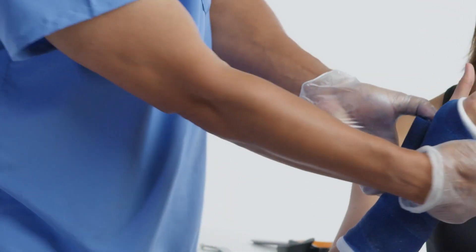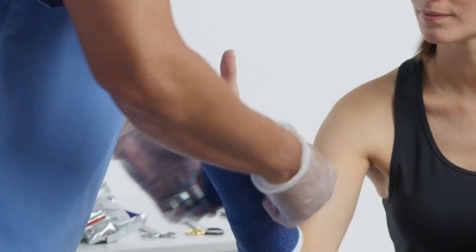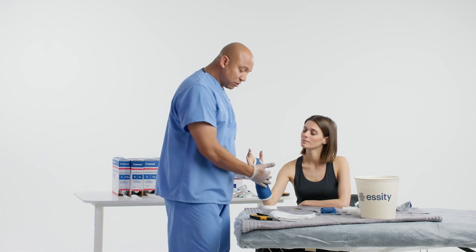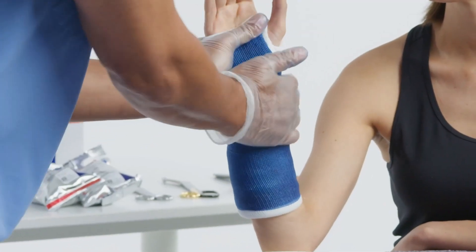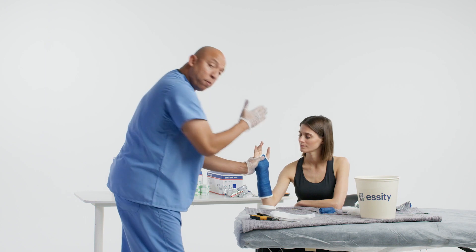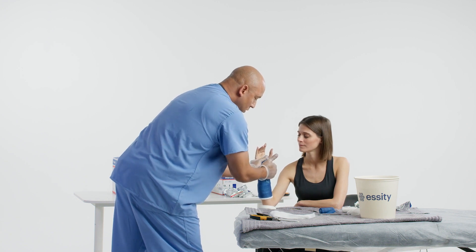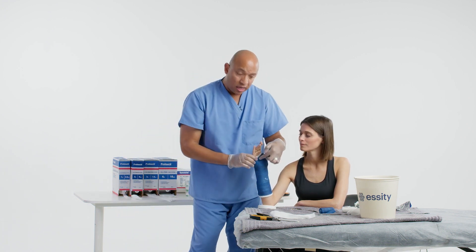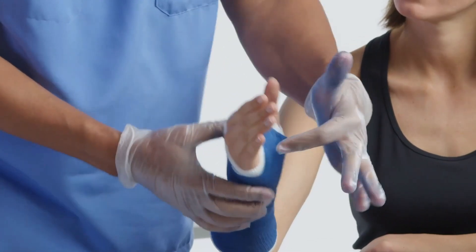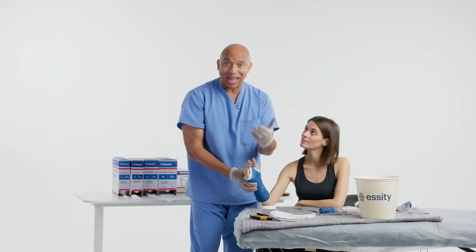I've folded it on both sides — now I'm just going to lock that in and finish out the last portion. Again, we want to laminate this last roll, so I'm just going to turn the hand around, take away that space in that palmar area, and put her back neutral. When you get done, you should see a more contoured look in the palmar area — we want to take away the space between the palm and the cast. We don't want a big club-looking type of cast.